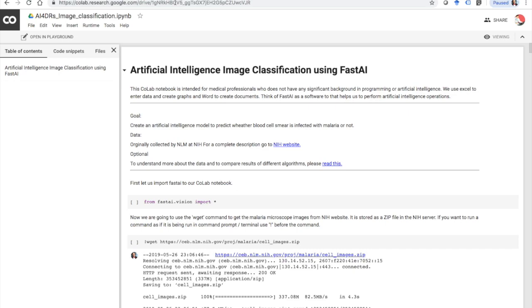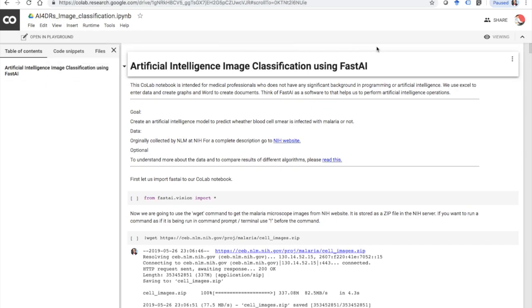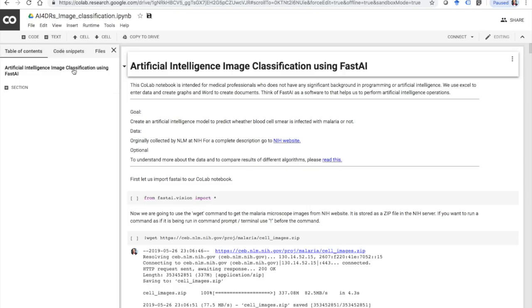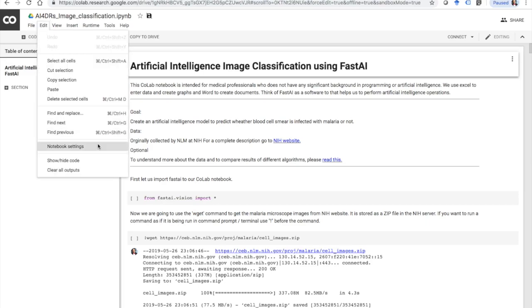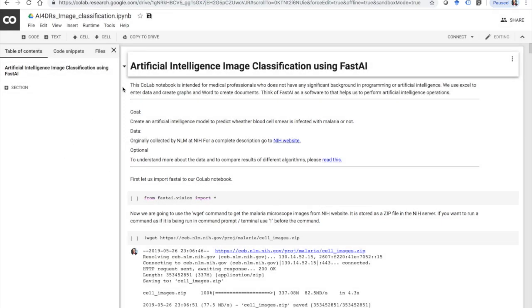With CoLab notebook you're able to do artificial intelligence programming without having an expensive computer or GPU or stuff like that. Make sure that you have this saved into your drive. Go to Edit, go to the Notebook Settings, make sure GPU is selected, save, and you can copy it to your drive. I would highly suggest that you click this button — copy to your drive — and then connect here.